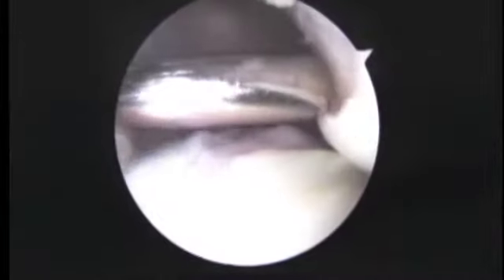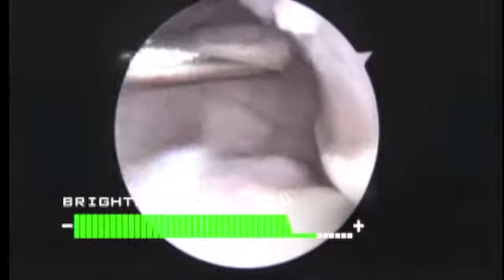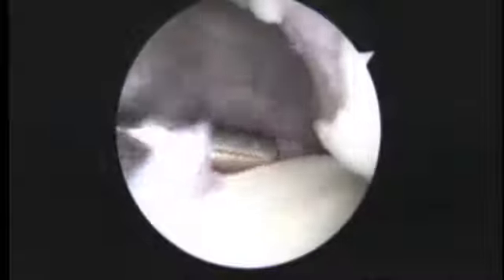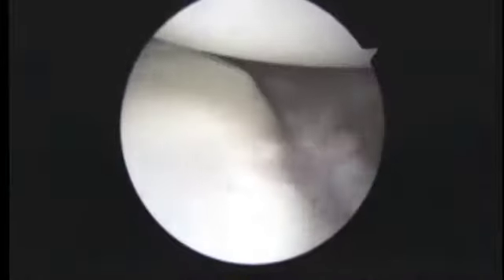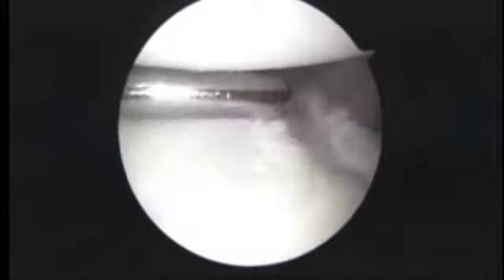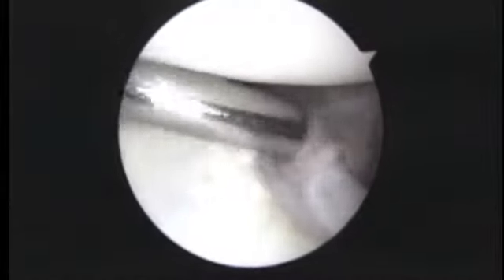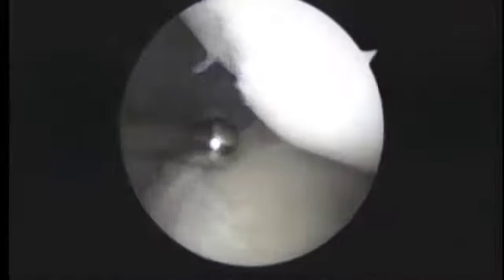As we look back here, we can see that this injury to the bone — what we call a Hill-Sax lesion — is actually pretty good-sized. You can see the switching stick coming in the back. I'm concerned because, especially since the posterior labrum is okay and the posterior capsule is open, you're missing some glenoid bone in this anterior inferior region of the shoulder. So the combination of missing bone here, the Hill-Sax, and how loose the shoulder felt means we need to help stabilize it. We're going to get that organized.